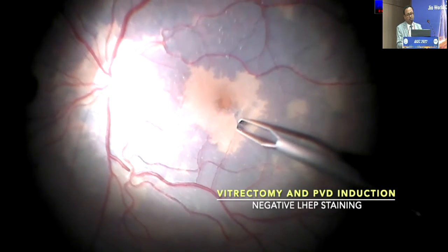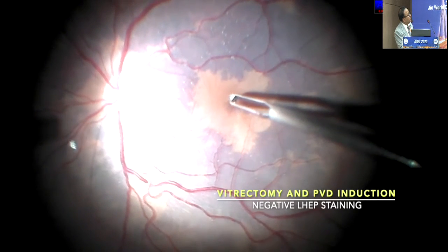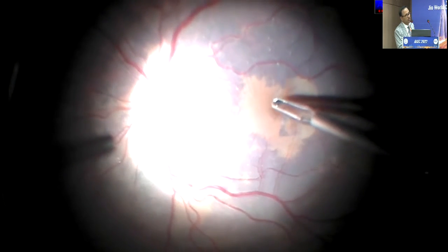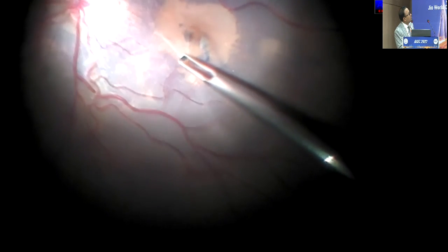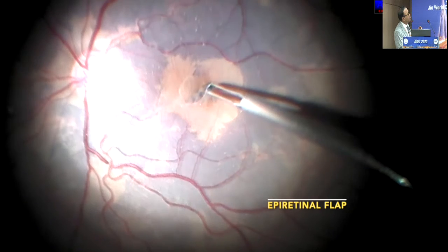induction, followed by brilliant blue staining. We can see negative LHEP staining here because of the membrane, and you start removing the membrane first around the ILM flap so that you can actually get into the membrane. You make a flap of the ERM over this. A few things you have to keep in mind, because there are a lot of appendages here, so you have to be very careful while you start removing the membrane.